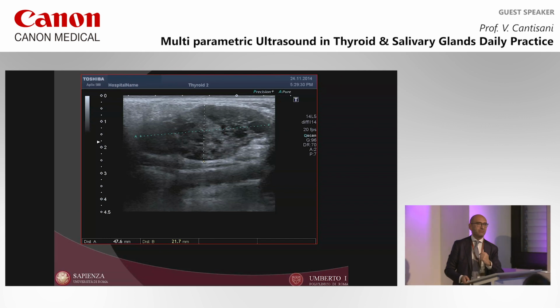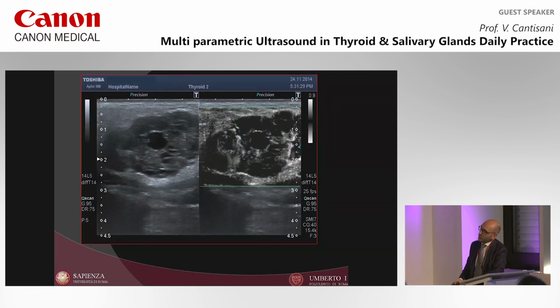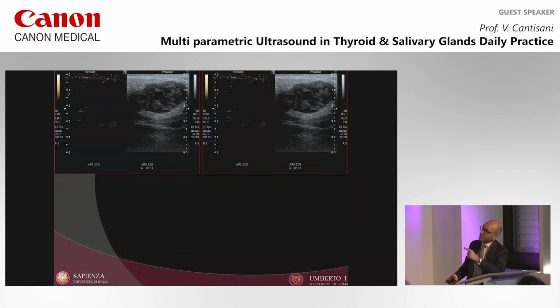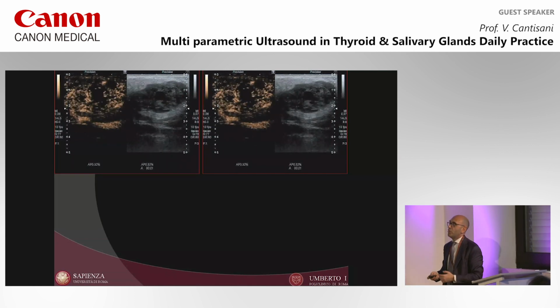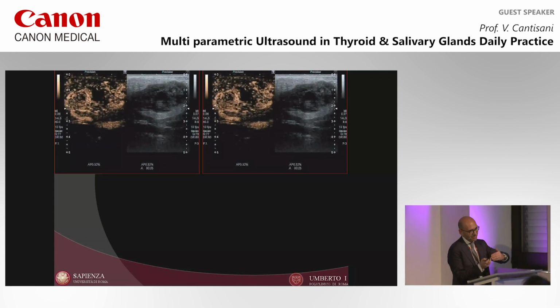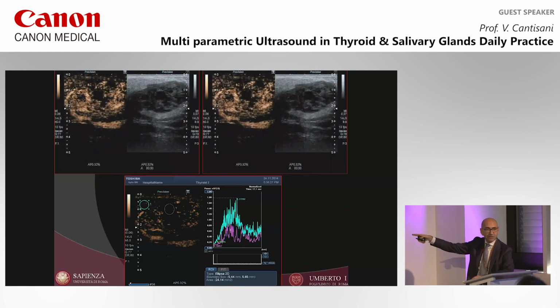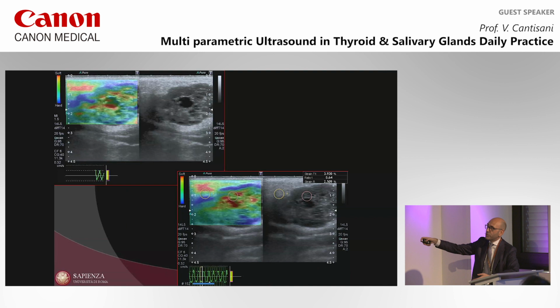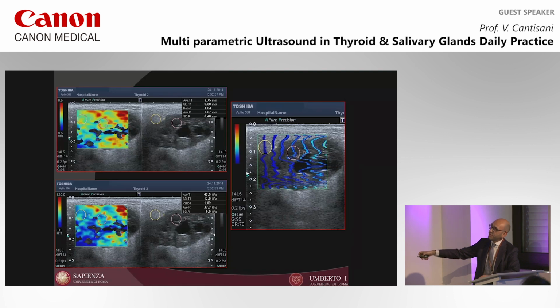Let's look at some examples. Vascularized, SMI. Could you, yes, okay, excellent. After CUS, the lesion shows a relatively intense area of vascularization. Of course, there are some cystic areas within. So, it is a vascularized lesion. You can prove it also by using the time intensity curve that can help you to be more objective in the evaluation. Elasto, in this case, was soft. Shear wave, soft.